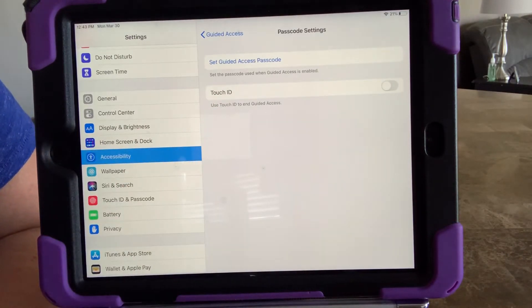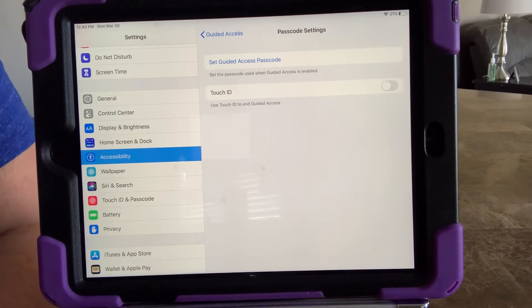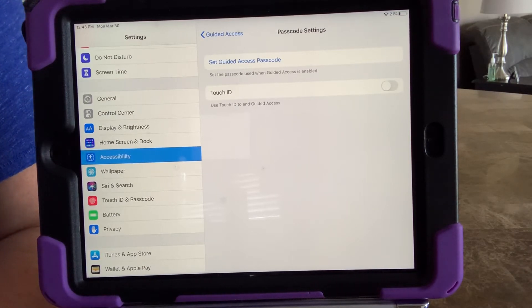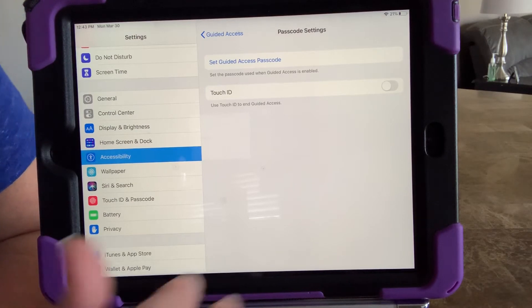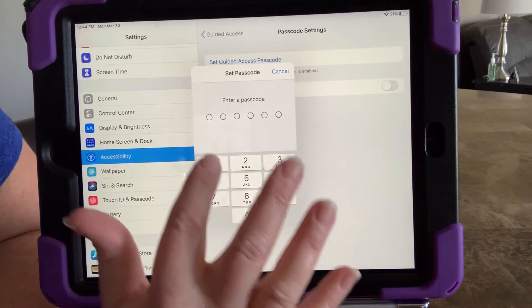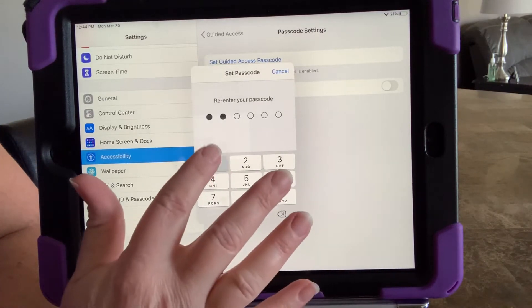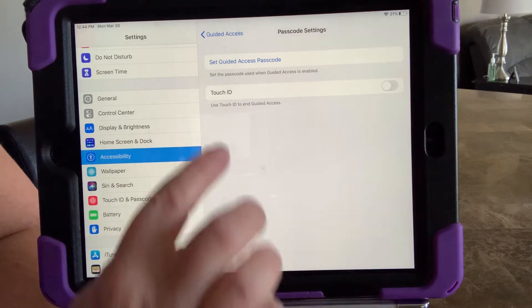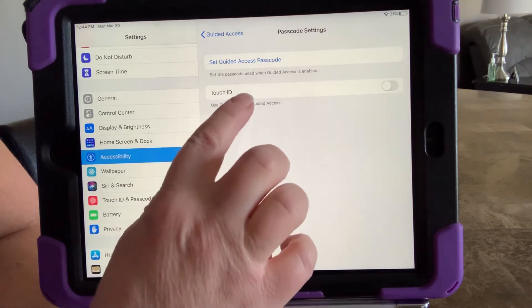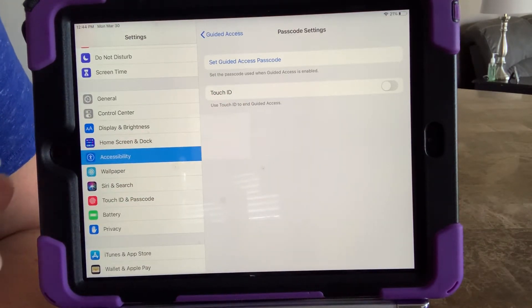If this is a device that's going between home and school or various places, and someone is going to need access to editing or maybe needs to get out of the app for certain things, we want to go ahead and set up a passcode rather than a Touch ID. Touch ID limits it to who can go in and change things, so I'm going to put in all ones and have that set.